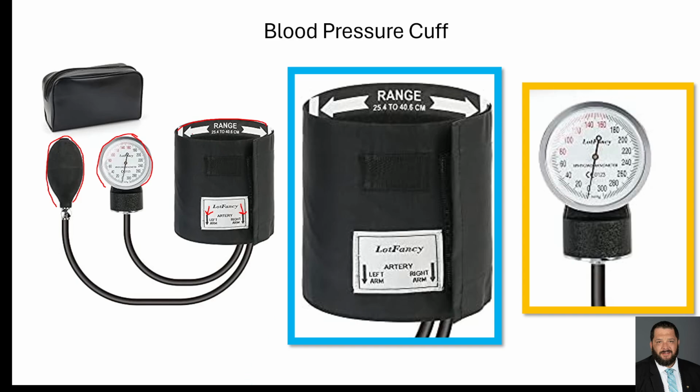It should be appropriately sized, and most of your blood pressure cuffs will have a similar size range on them. The end of the blood pressure cuff, so the very end here, when it's placed on the patient, should land somewhere within this range. If it doesn't fit in that range, you need a larger blood pressure cuff. If it goes too far in the range, you're going to need a smaller blood pressure cuff. These are calibrated to give specific readings when they're appropriately sized. Using an inappropriately sized blood pressure cuff, you're not going to be able to get an appropriate and accurate reading.